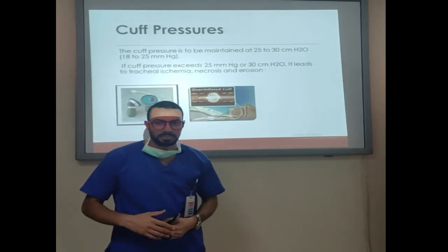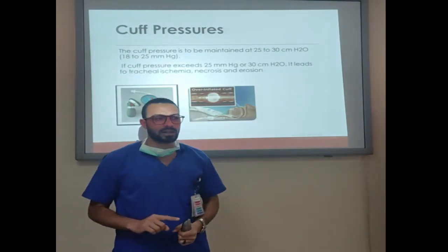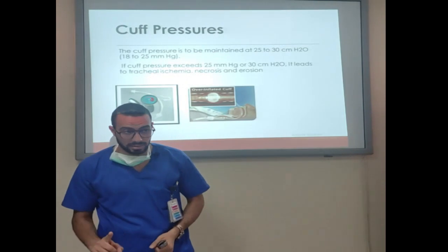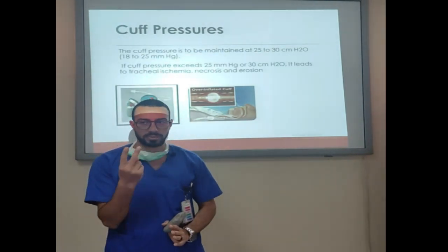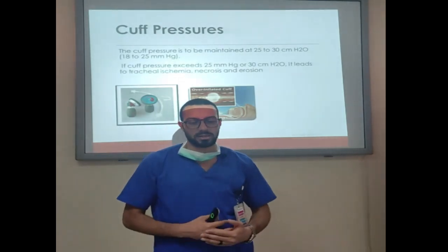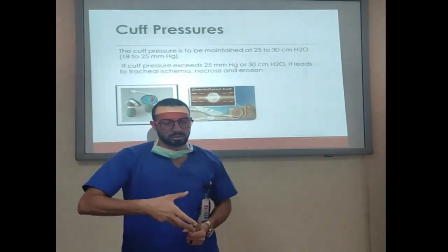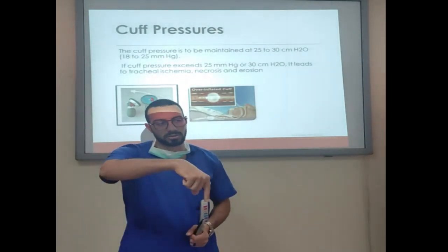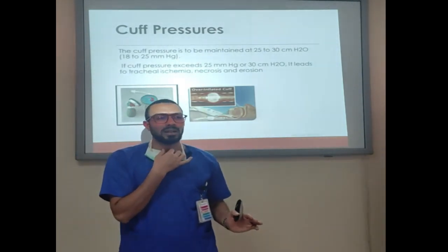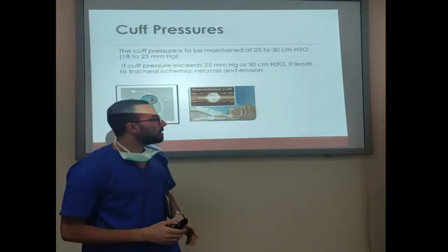So you should take care. According to the hospital policy and some guidelines, we should deflate the cuff every 2 hours and assess the cuff pressure. To deflate is just to minimize the pressure on the patient every 2 hours. Unfortunately, as I told you, RT here, they don't do this, but normally we should do it every 2 hours: deflate the cuff, assess with the manometer, and then inflate to the normal range, and then leave it for 2 hours, just to let the trachea rest. It's like positioning, when you reposition the patient, it's the same idea.